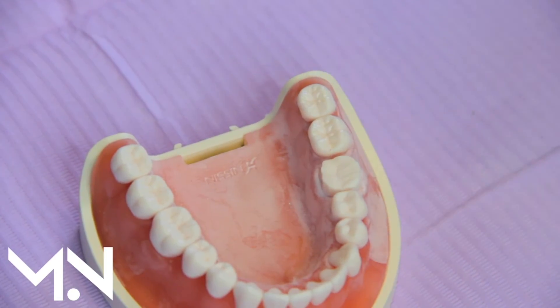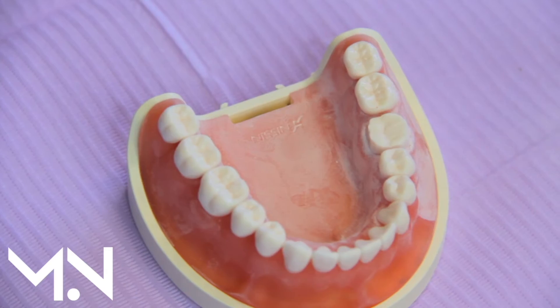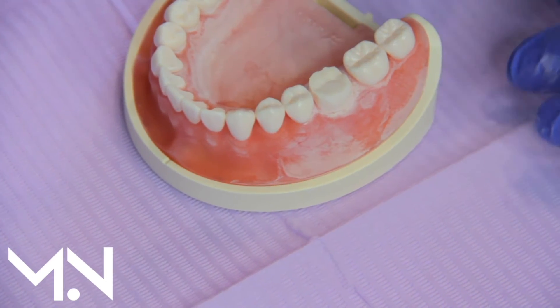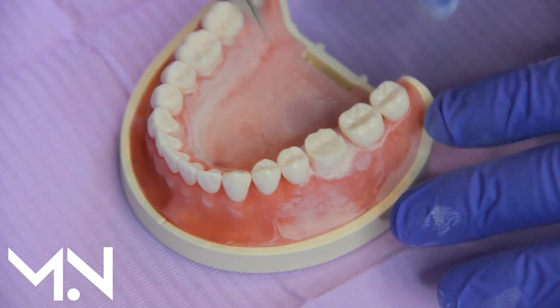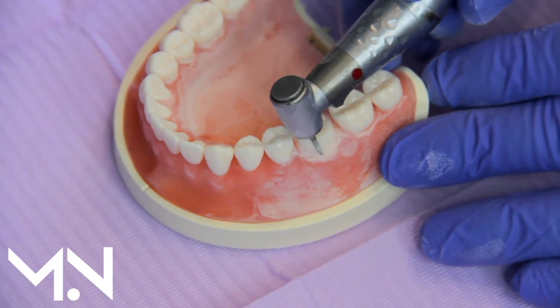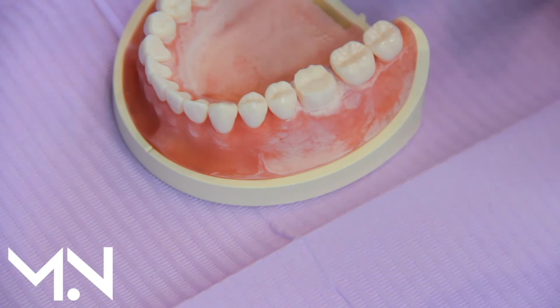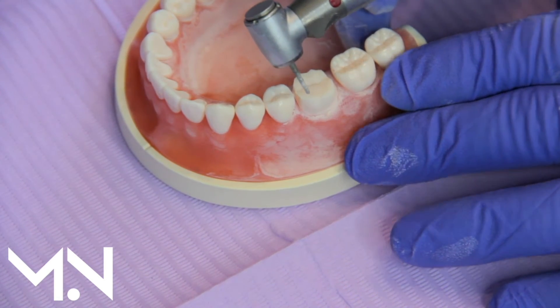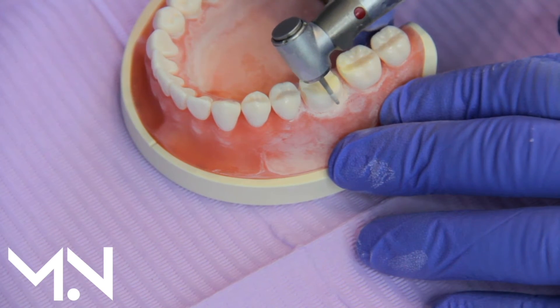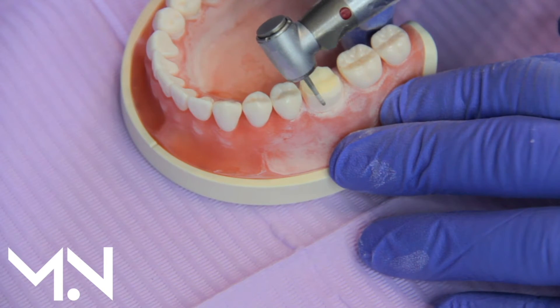Now we have what's called the gross reduction of the crown done, meaning we've reduced a majority of what we need to. But we still need to finesse and create a shape so something can come over this. To place a crown I need it to come straight from the top all the way over, so the crown needs to taper — each side leaning inwards — so it can sit over the top without getting stuck.